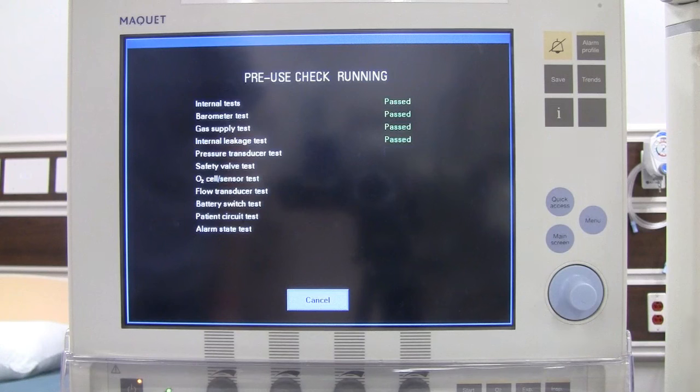The Servo-i has interchangeable modules that can be used on all Servo-i systems, including an optional CO2 analyzer, different sensors, electrical activity of the diaphragm, different battery modules, and expiratory cassettes. Plug-in modules and extra batteries can be inserted or removed during ventilation. It also has a quick automatic pre-use check of the entire system, including the breathing circuit, which is what we are doing now.